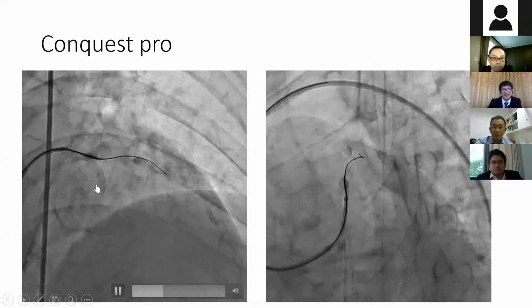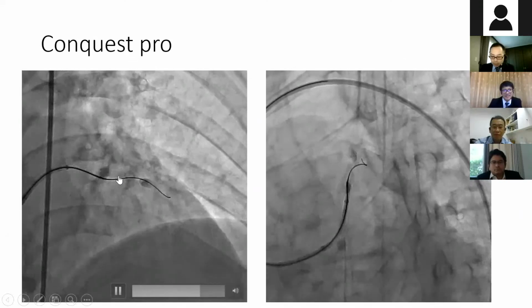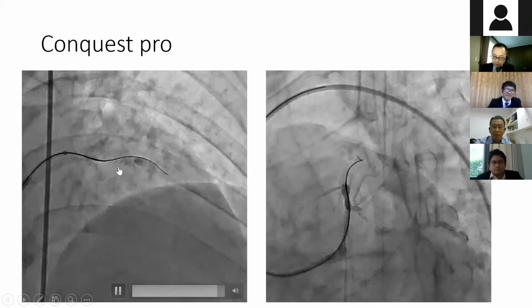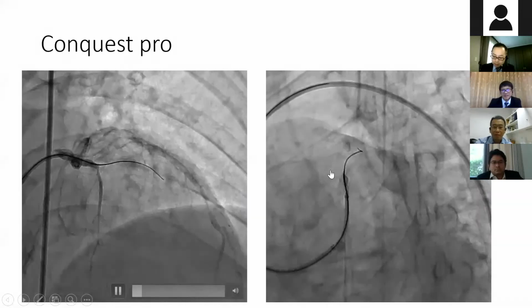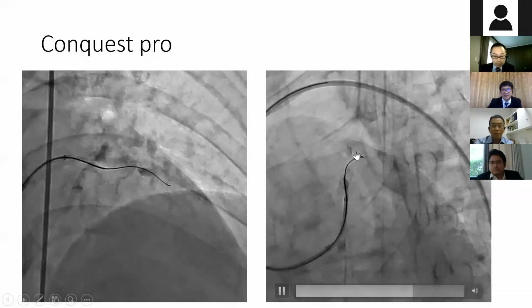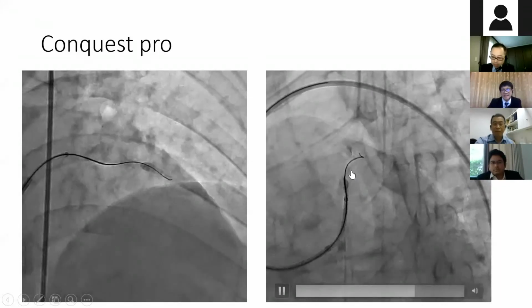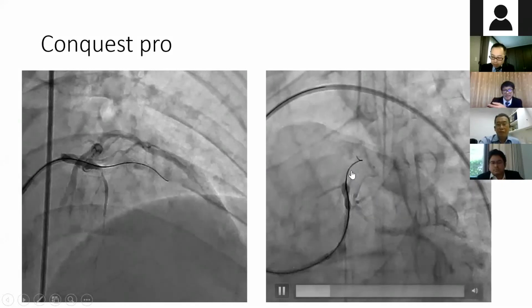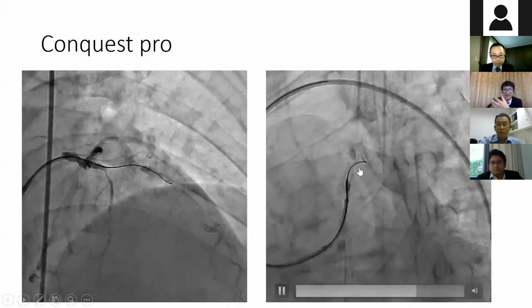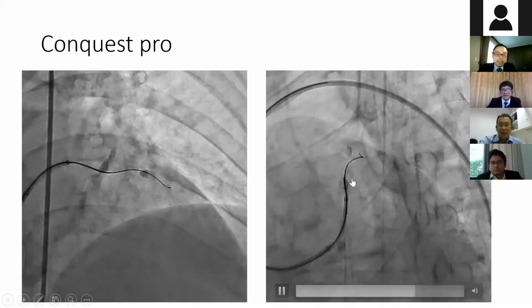With the stiffer wire, I could puncture the proximal cap of the CTO body, but I could not redirect or advance the wire to the distal cap. I felt something with very high resistance before the distal cap, and the Conquest Pro went away, outside the vessel lines.